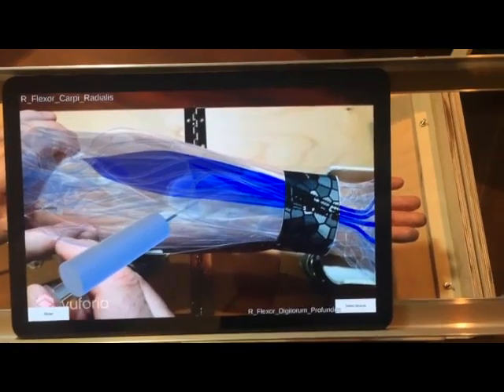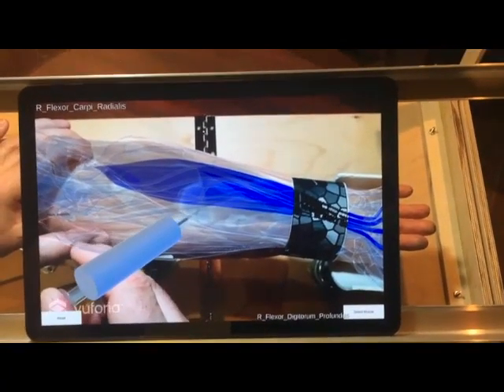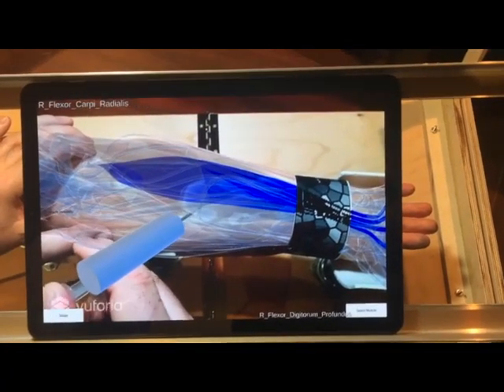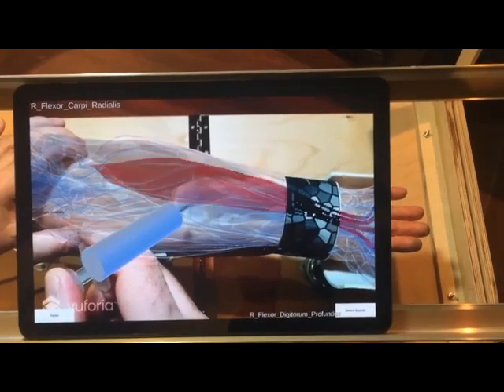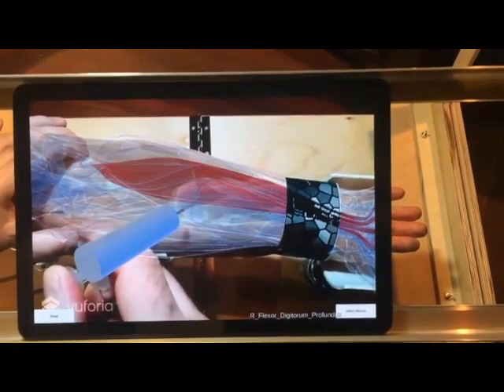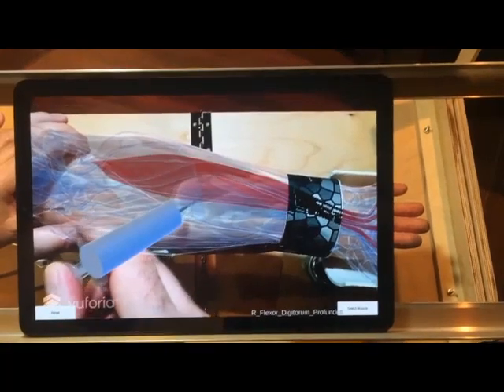The MyoGuide ARM is an excellent learning tool to reinforce toxin injection technique. The lifelike model can be palpated to provide realistic tactile feedback.